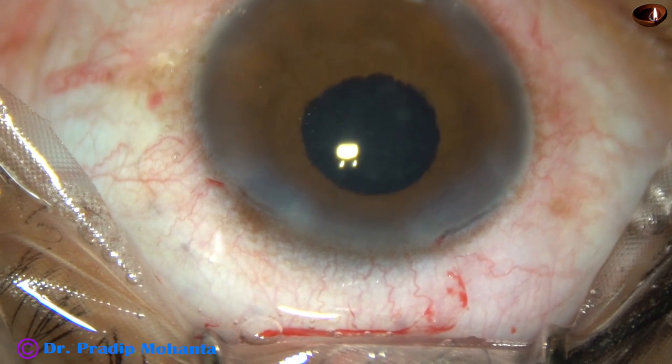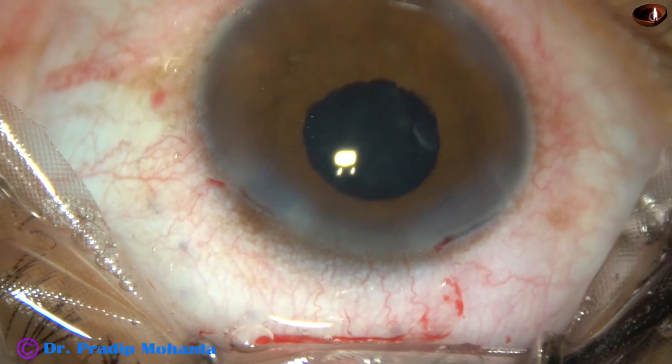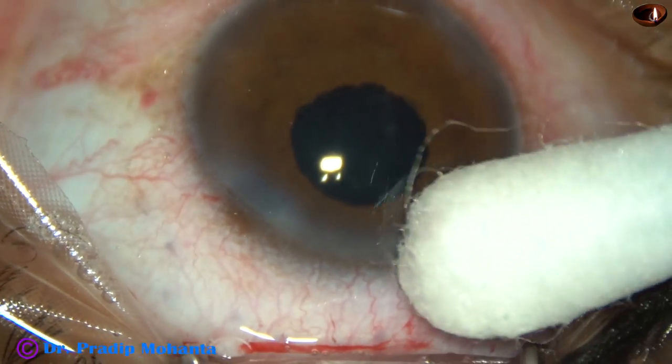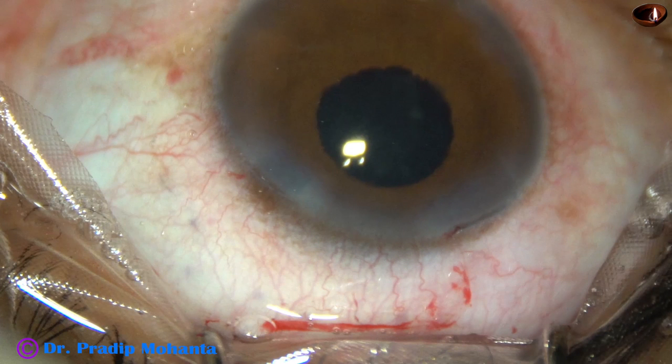And this is not the end of the case — you have to check all the wounds. You must check: there should not be any leakage or fluid from any wound, and there should not be any leakage or seeping from any site.